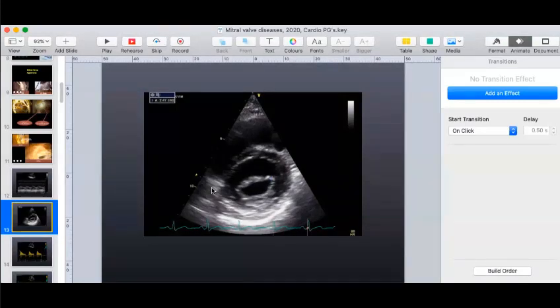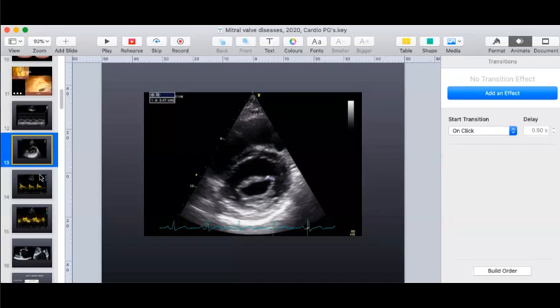Next is if you have a lot of calcification, so you again have problems. You may not be able to get the exact tracing. You might have very fuzzy, or maybe sometimes even dropouts at the point where the leaflet margins are. So you may not be able to trace it properly. In that case, the best you can do is try to reduce the gain and try to get the orifice delineated in a much better way. So some sort of limitation as far as 2D planimetry is concerned.